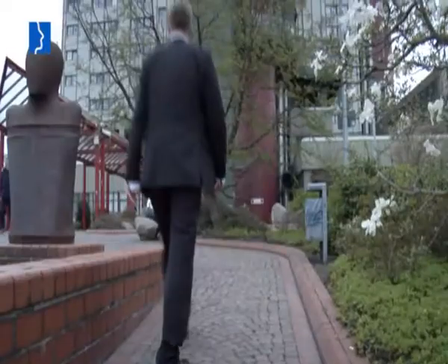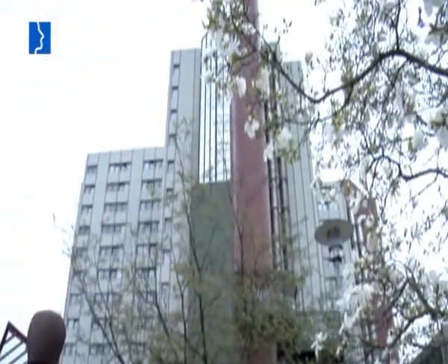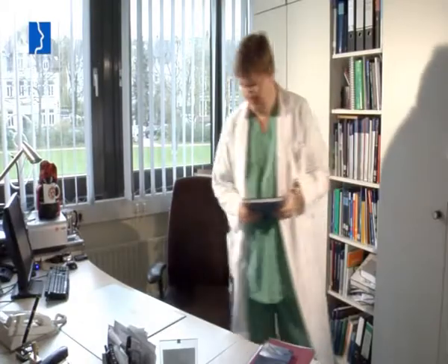Professor Dr. Sudhoff developed this minimally invasive method at Klinikum Bielefeld Hospital. For the first time, it's now possible to treat adult patients with chronic ventilation disorders of the eustachian tube quickly and successfully. There's a whole series of patients with ventilation disorders. It's assumed that about 1 to 5% of the German population has difficulties in ventilating the ear properly. And you know that an impaired eustachian tube function can finally also lead to chronic bone suppuration and chronic middle ear infections.